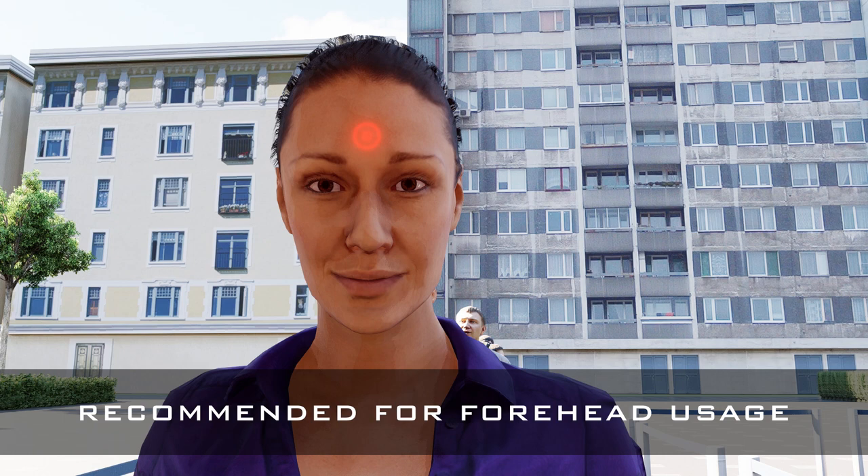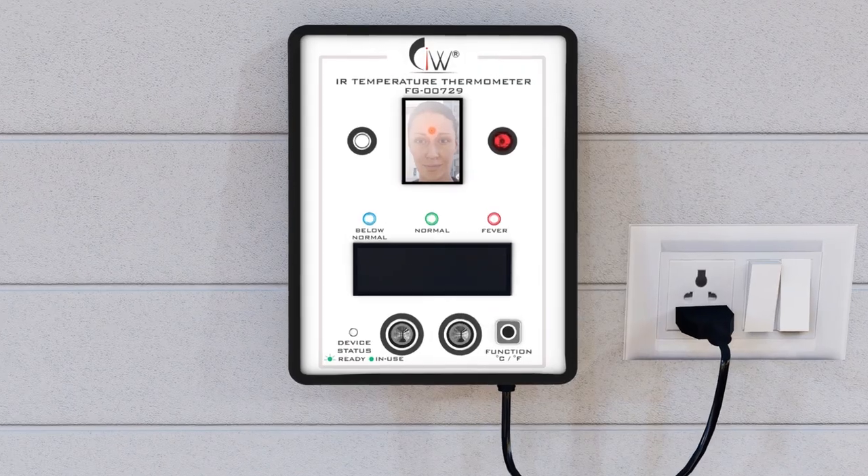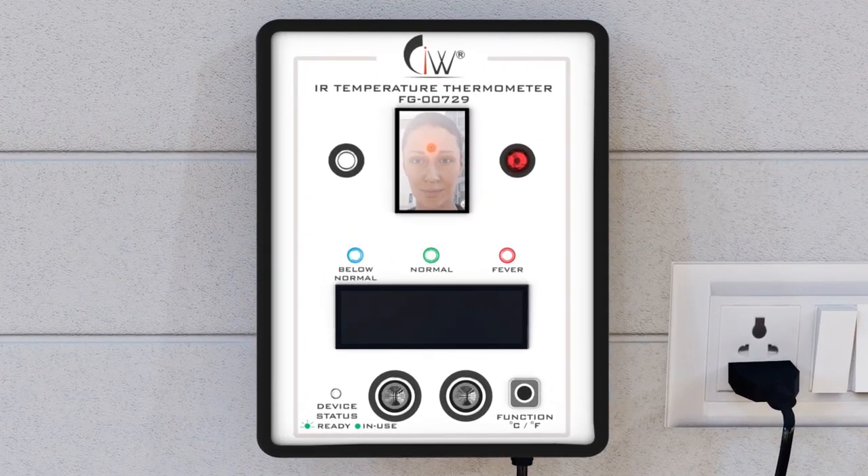A spotlight will then beam onto your forehead. This will automatically activate the high focal range infrared sensors and give you an accurate temperature reading in less than a second.